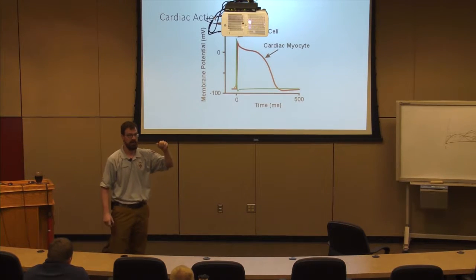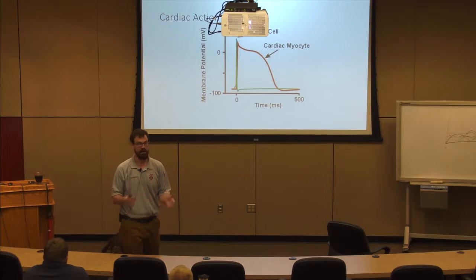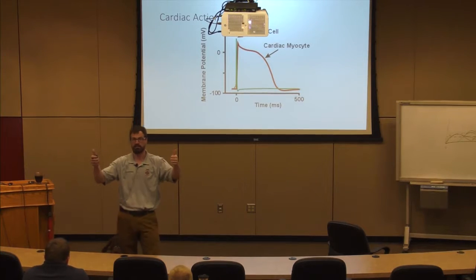If I have a guy who is seizing or I get called to a seizure and I notice that they have a wide QRS and runs a VTAC, I'm thinking sodium channel blockers, right? I'm thinking sodium abnormality, low sodium, right? Or sodium channel blockade. That's the classic manifestation of severe tricyclic is seizures and VTAC, okay?